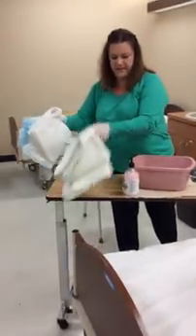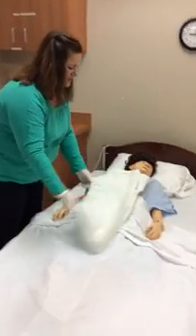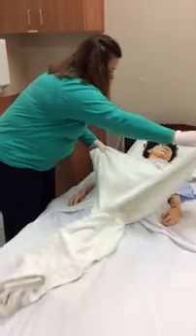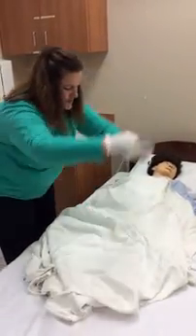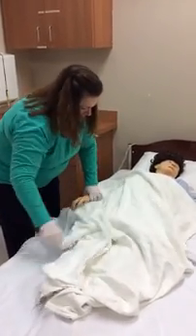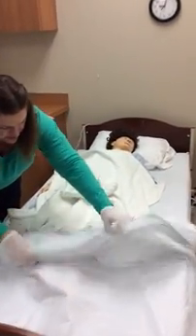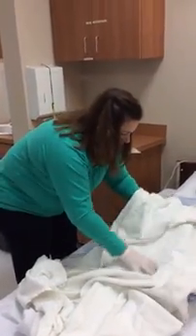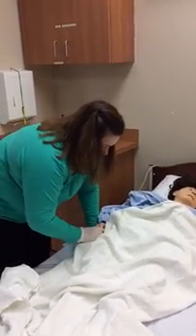Okay, so first I'm going to put a bath blanket on you to keep you warm and give you a little bit of privacy while we're doing this skill. Whenever you are opening any kind of linen over your patient, do it directly on top of your patient. Don't hold it up above the bed and open everything up. I'm going to pull the sheet down. And I like to just pull the sheet down just to cover the feet. And you need to pull the patient gown up because this skill requires you to keep the linens dry and the gown and everything dry.